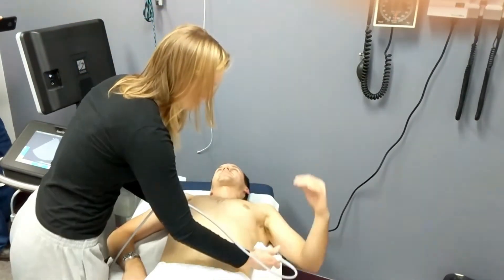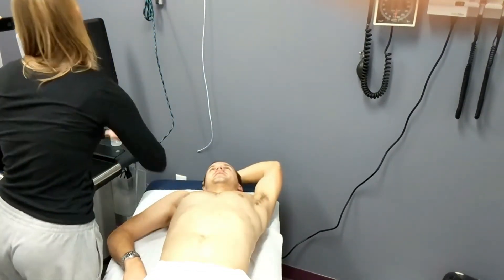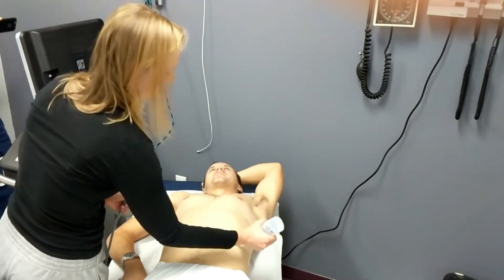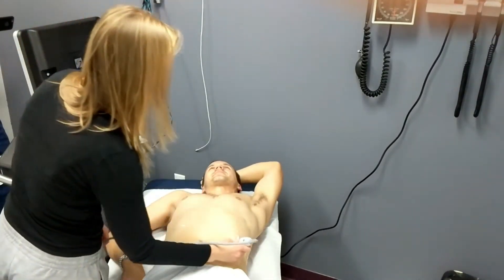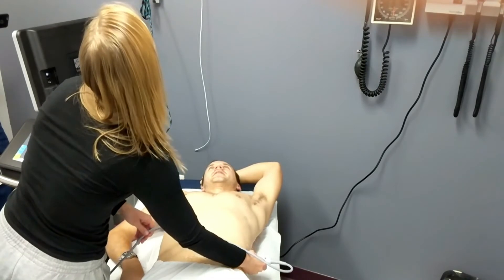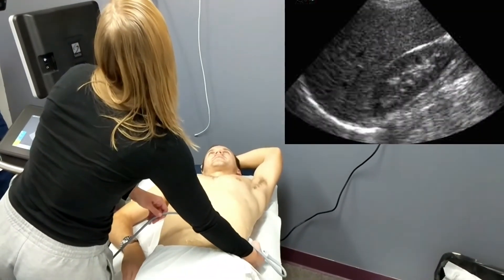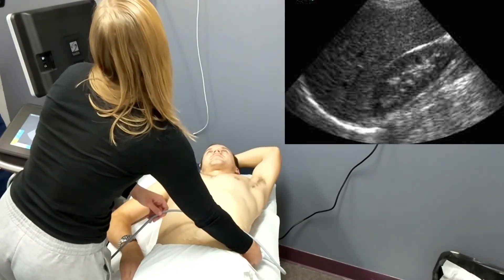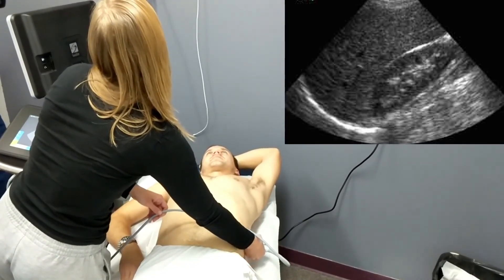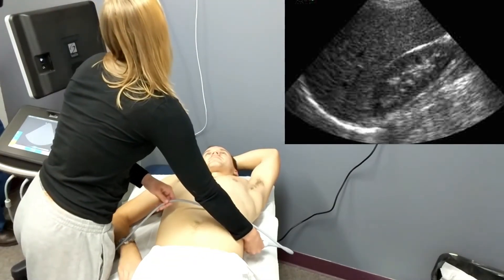She now moves on to the other side, where it's important that she tries to place her examining hand knuckles on the table to get to the retroperitoneal space, so she can examine for any signs of fluid collection between the spleen and the kidney on that side. Once again, she's looking for that mirror image sign of the lungs on the other side of the spleen.